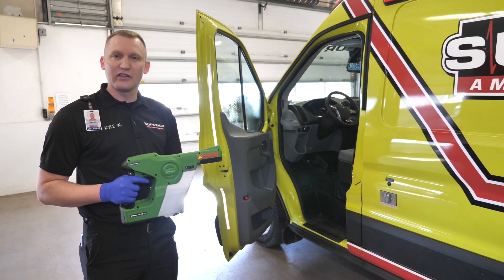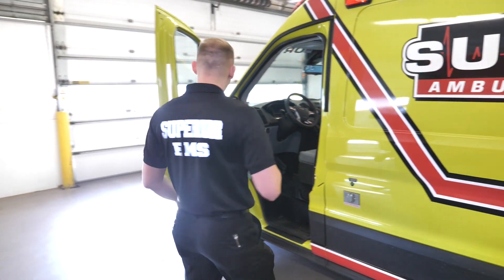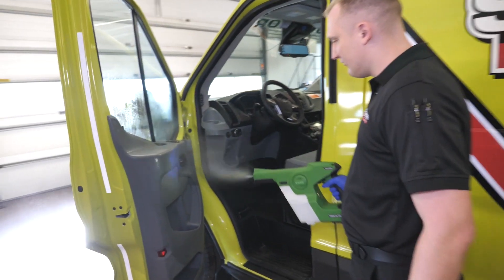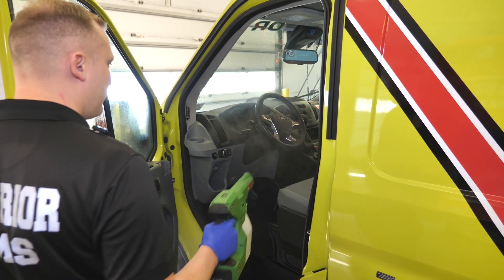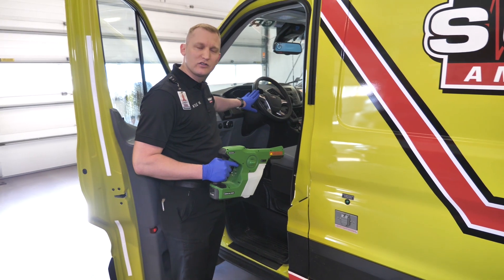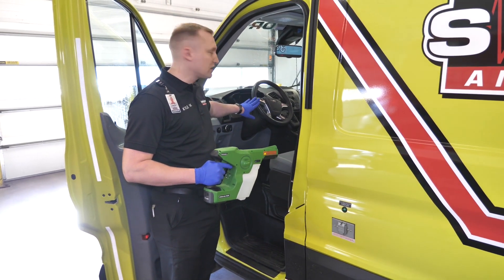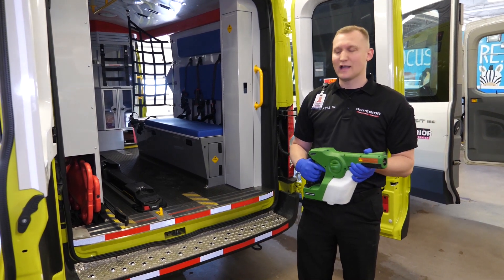Let's start with decontaminating the front of the ambulance. We take our electronic decontamination sprayer and spray the front of the vehicle entirely, making sure that we get all surfaces wet. We want that surface to stay wet for two minutes to allow the decontamination process to occur. Once the front of the vehicle is decontaminated, we move to the back of the vehicle.